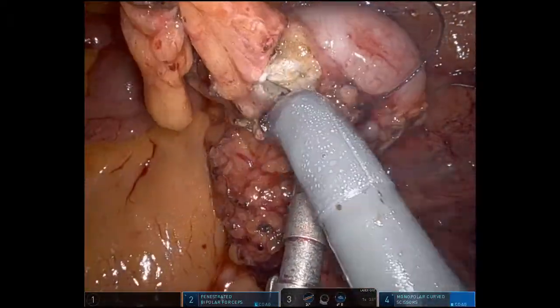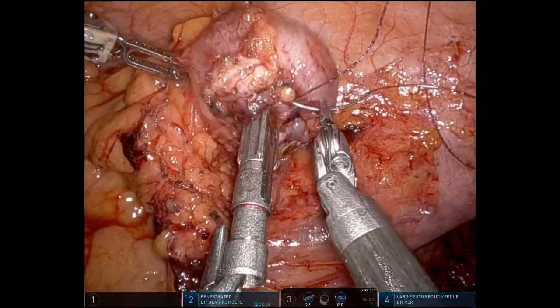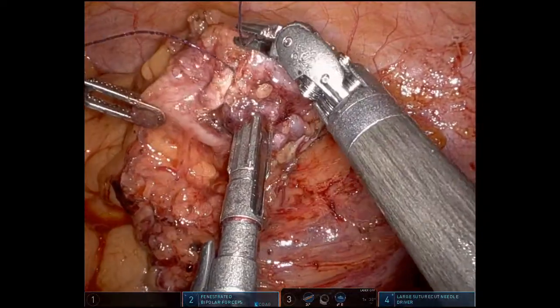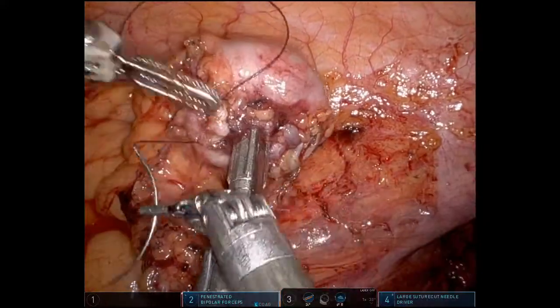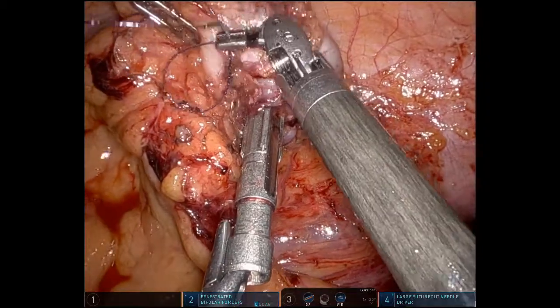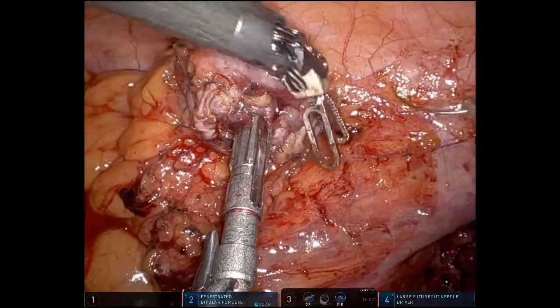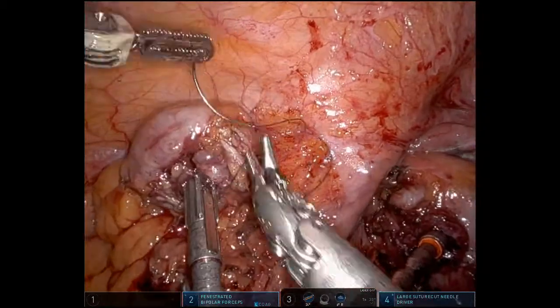You've got to be careful to take the specimen out right away — you don't want to leave that in. And now because we have our V-lock still intact, I'd like to leave it intact. We just basically do another purse string engaging the edges of where we cut the tissue, making sure that we pull it all in. That's getting around the larger defect. And now we're going to take the same suture and make sure we get the smaller cut diverticulum edges, putting it all in close to the neck of the anvil.